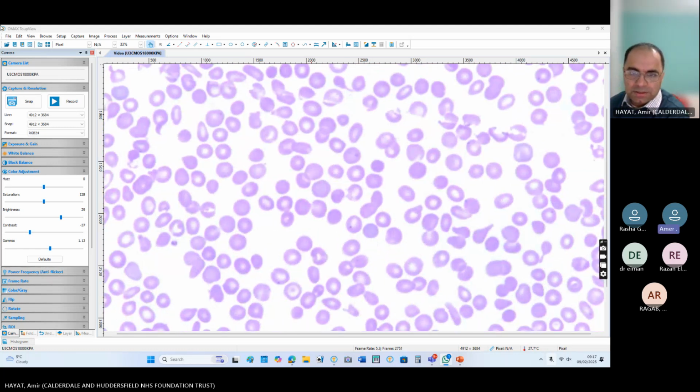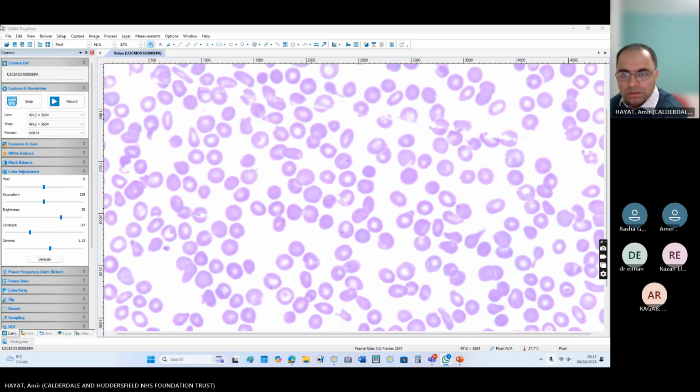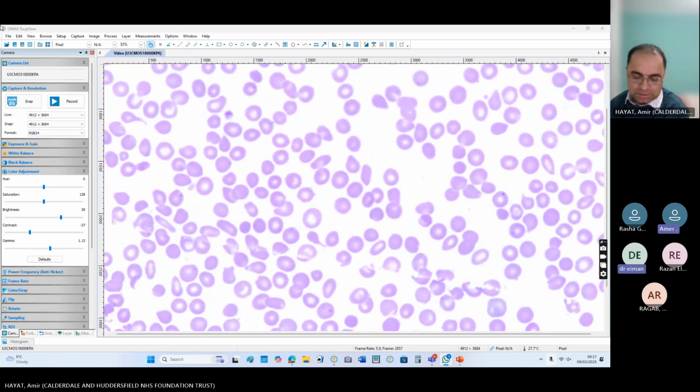So let's say I tell you this patient has abdominal discomfort because of splenomegaly. Now this patient has anemia, splenomegaly, and this is the blood film in front of you. With the feature of teardrops in general, we will suspect myelofibrosis.